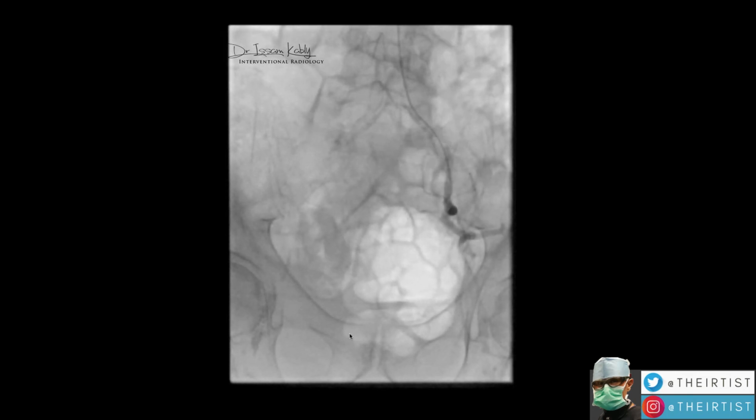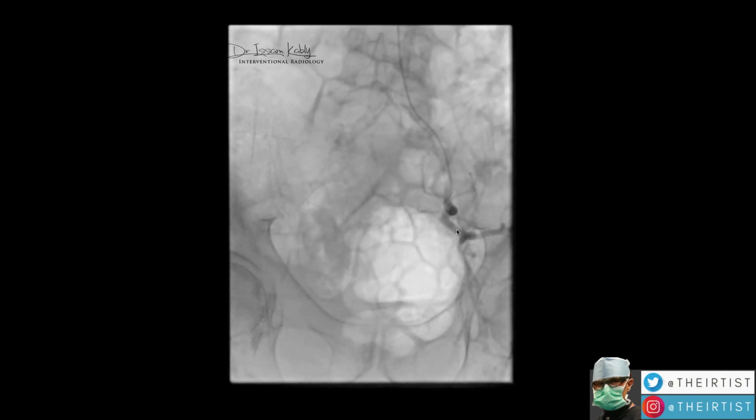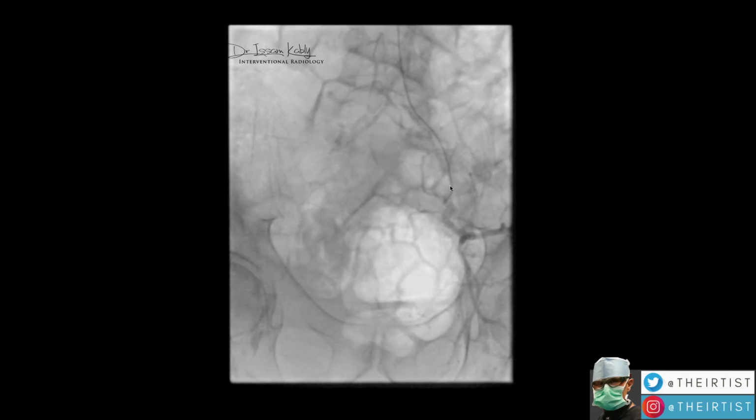This is the patient's hip area. The prostate should be around here. The bladder should be around here. Of course, we don't see it with the x-ray. We don't see solid organs. We only see our catheter coming into the vessels and injecting the contrast, the dye that allows us to see the vessel. So we can reach the internal iliac vasculature extremely rapidly. It takes us literally 30 seconds from the patient's wrist to be there.